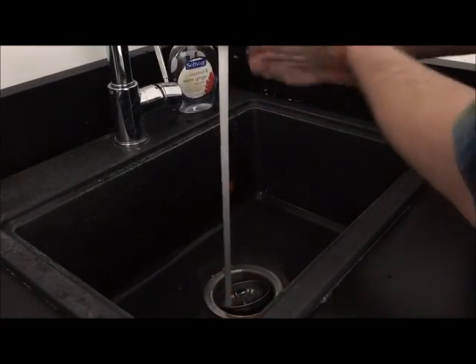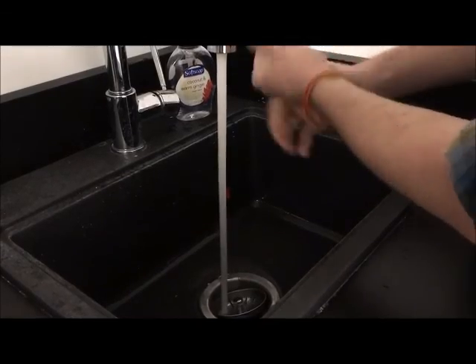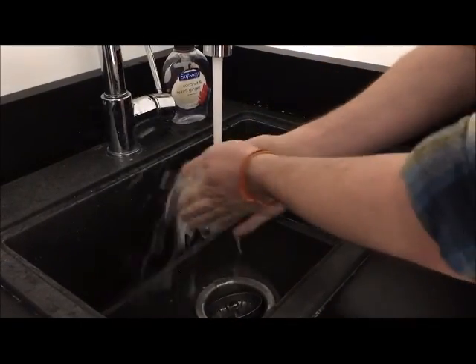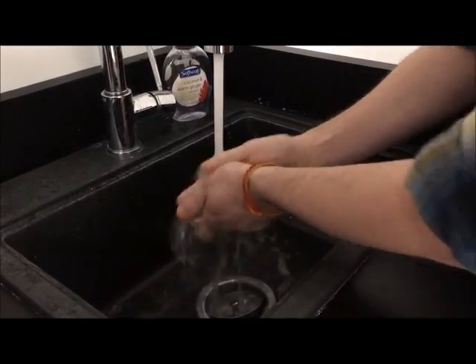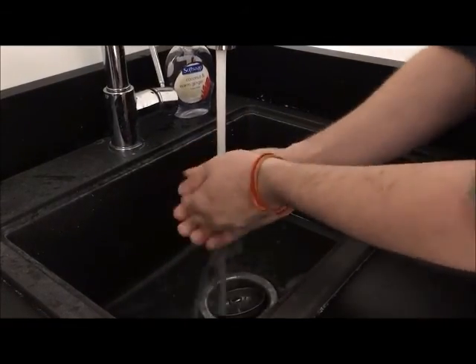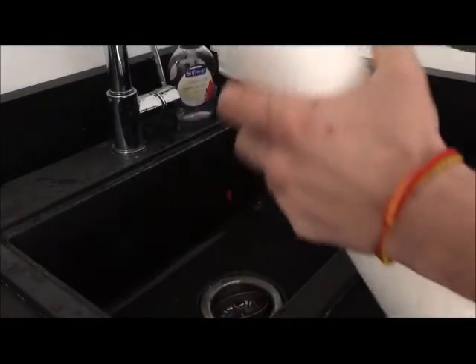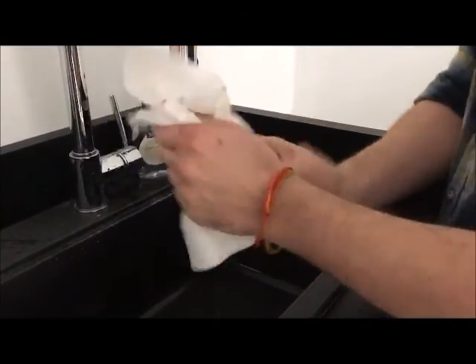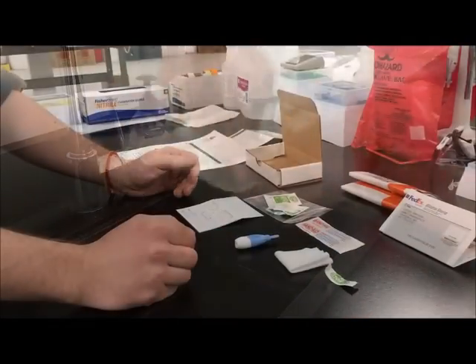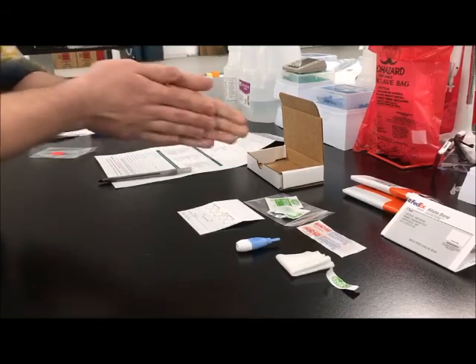Wash your hands with soap and warm water. Dry your hands thoroughly with a clean paper towel. Rubbing the hands together for 10 to 15 seconds will increase blood flow, aiding in sample collection.